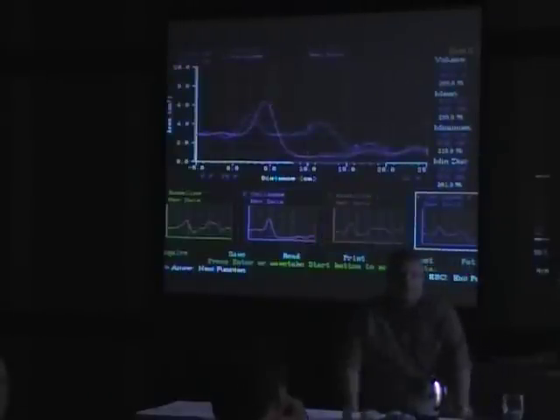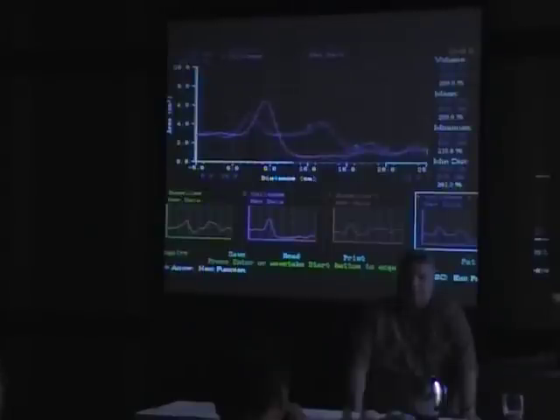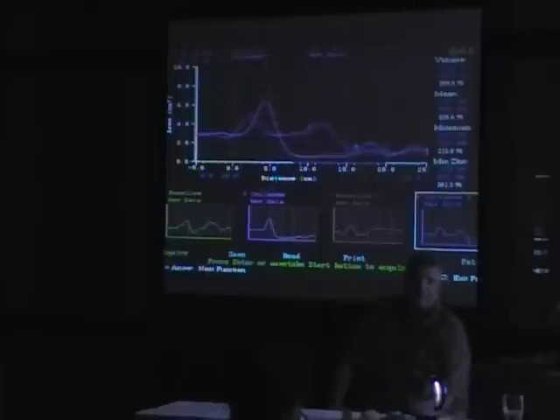Okay. What is the blue line? Worst case scenario, you had no time to titrate him. You've had no time for his airway to heal. You've done nothing other than arbitrarily open him up and move him forward. Have you done anything to fine-tune this gentleman or let him heal?